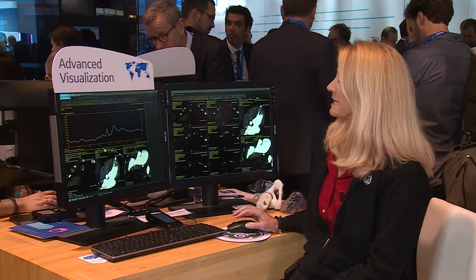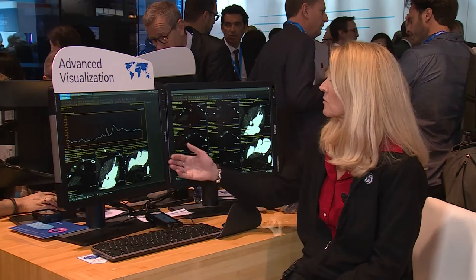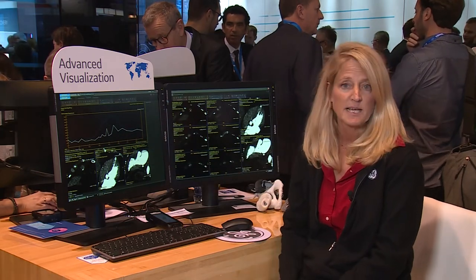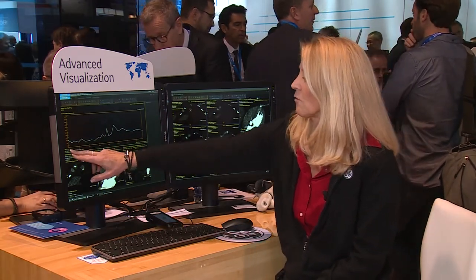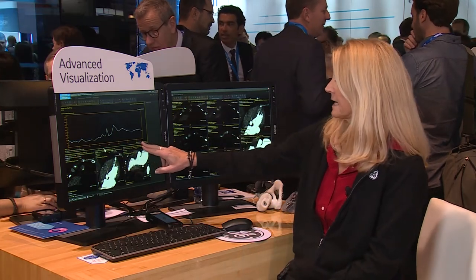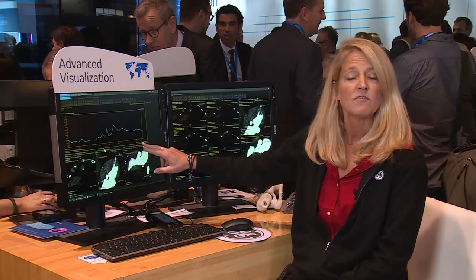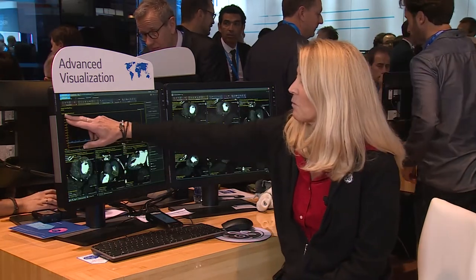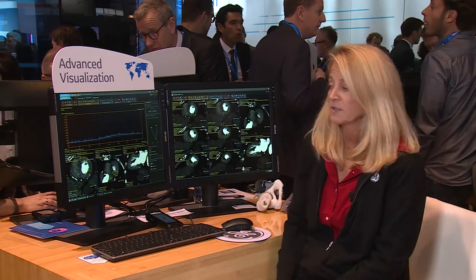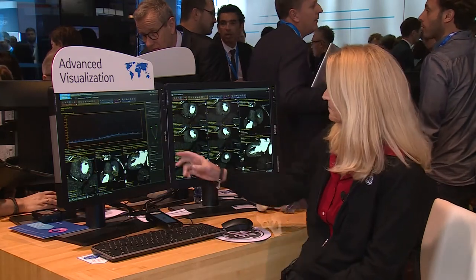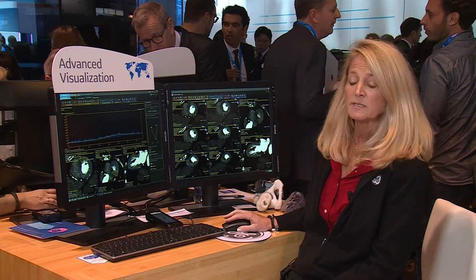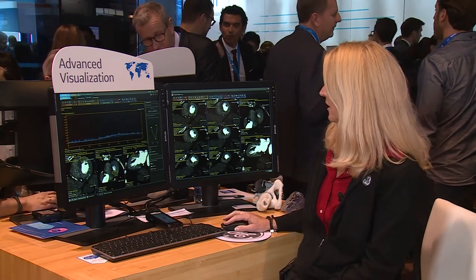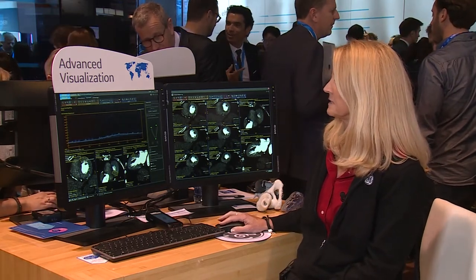When the segmentation is finished, we'll be able to see on the graph all 17 segments and how the segments are over time. On the x-axis I have my time frame, and on the y-axis is my Hounsfield units. It's now segmented the myocardium into those 17 segments.